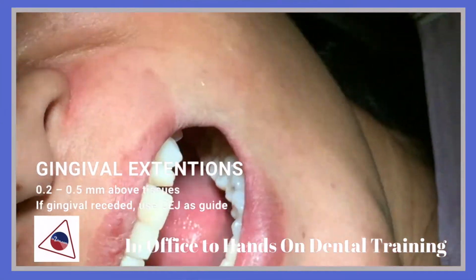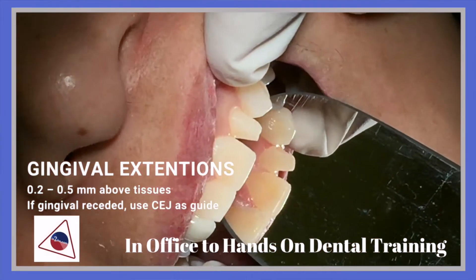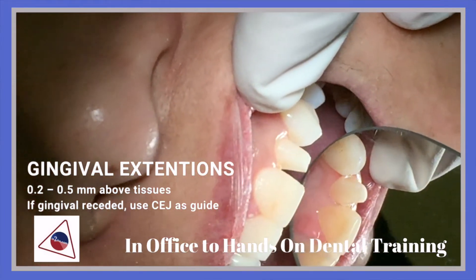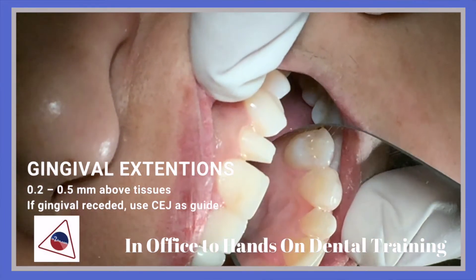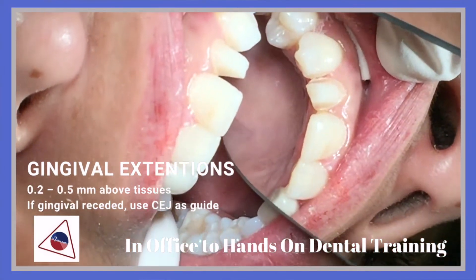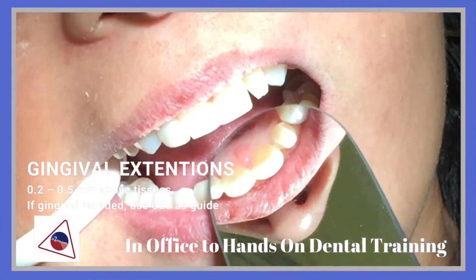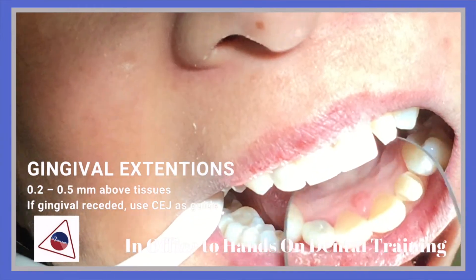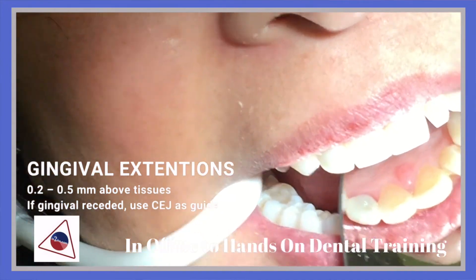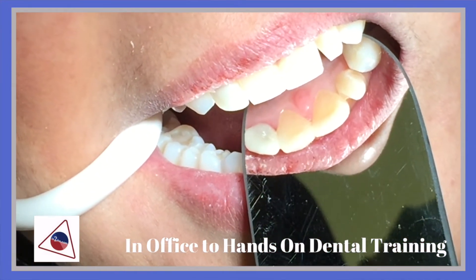Now the gingival extension that we have to note would be here. That would be about 0.5mm above the tissue. We will be using the CEJ as the guide for the position of the margin.